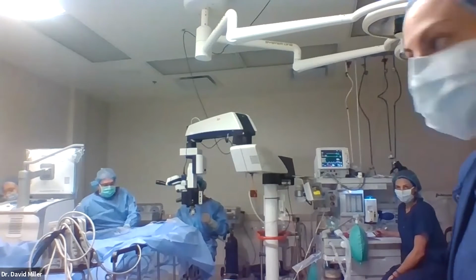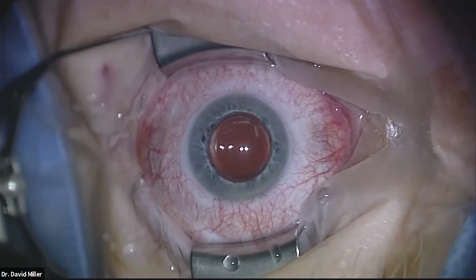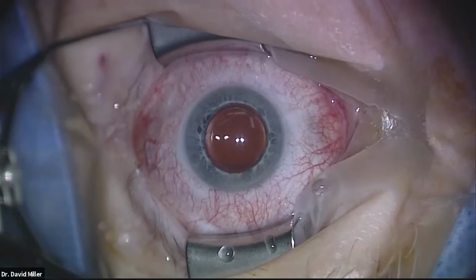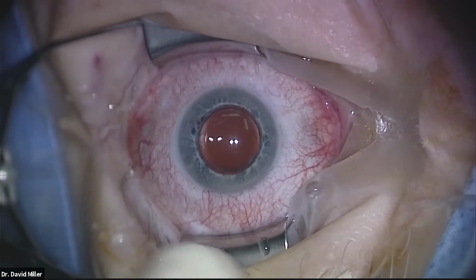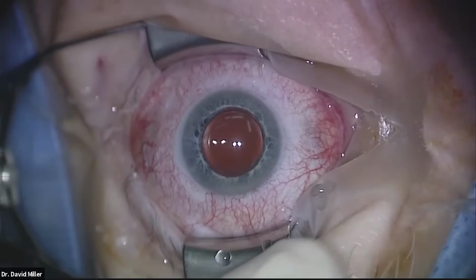And the patient's already been blocked. I use a retrobulbar block, very little sedation, and that's about it. And then we prep, the betadine being essential for any eye, properly draped with the lashes out of the way. You'll notice there's no eyelashes in the field of view because we do consider that a higher risk for endophthalmitis infection.